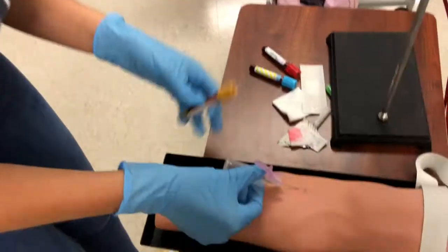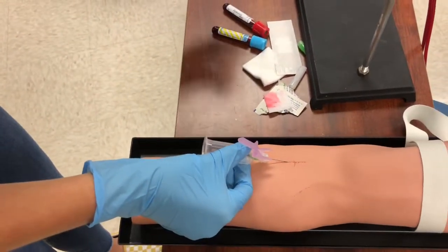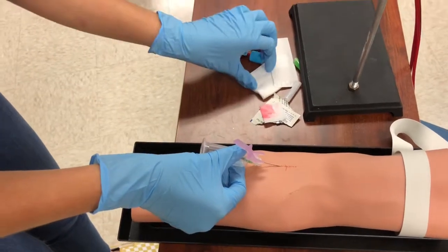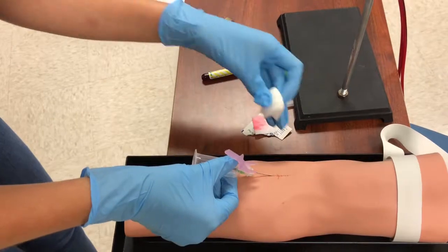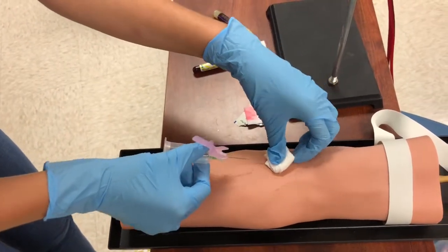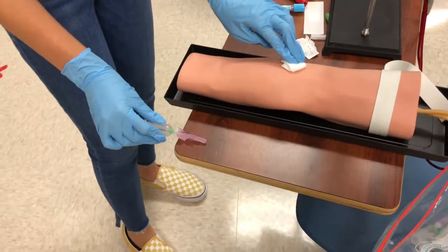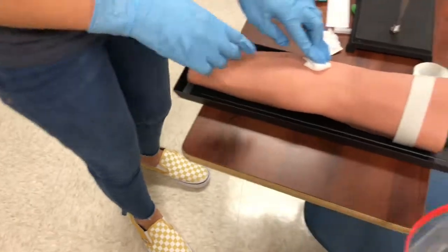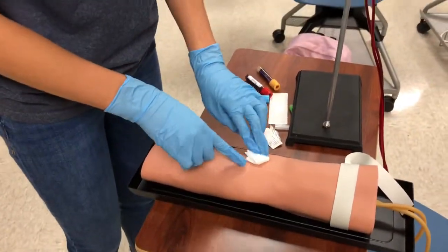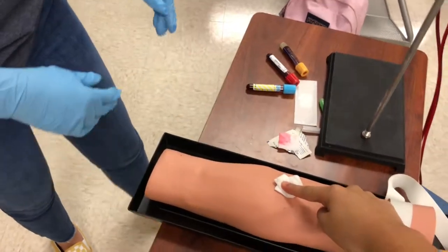I saw good blood flow so I release the tourniquet. I then put the safety cap on the needle and place it into the biohazard container — in this case it was a bag. I ask the patient to hold the gauze in place and continue applying pressure.